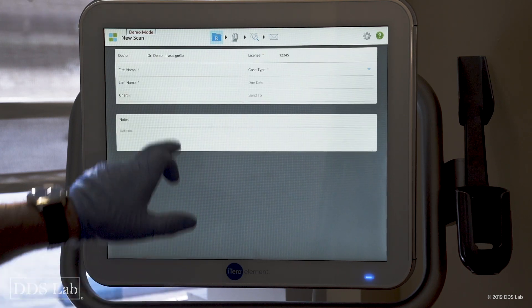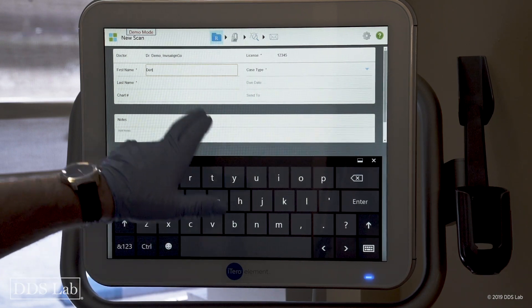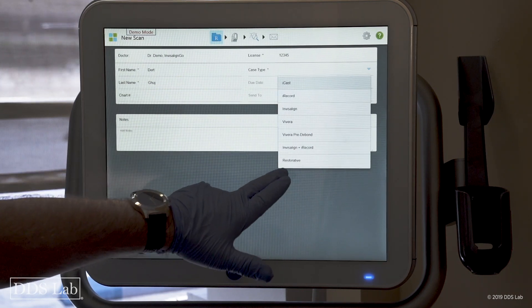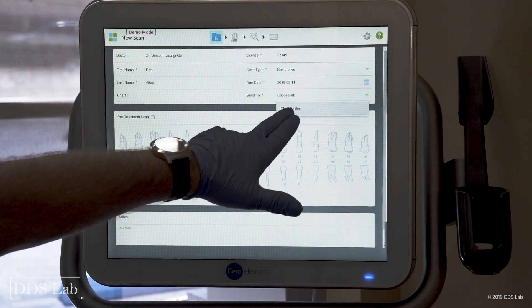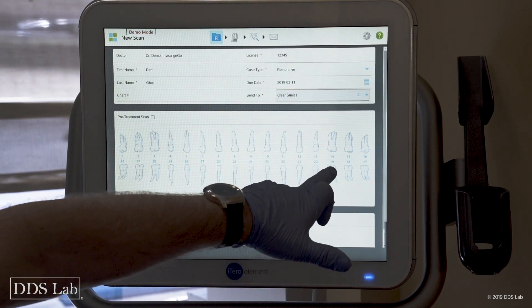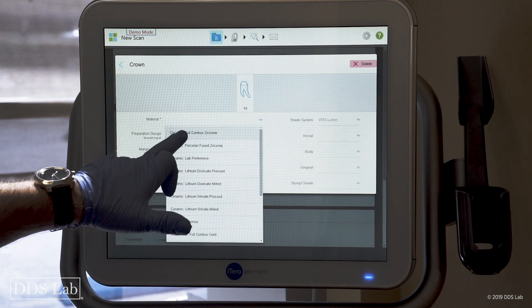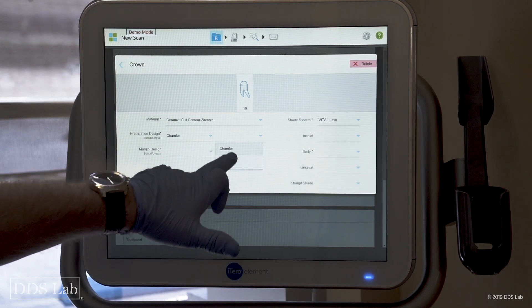I'm going to fill out the RX — I type in a random first and last name, choose the type of case which is restorative, choose the lab, and choose the tooth I'm scanning: it's number 19, it's going to be a crown.